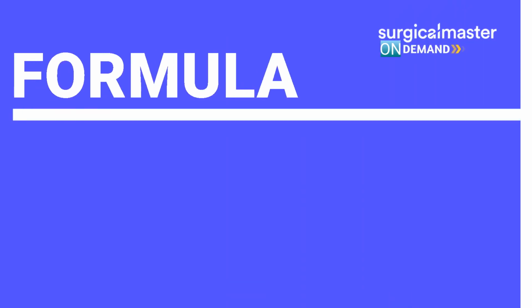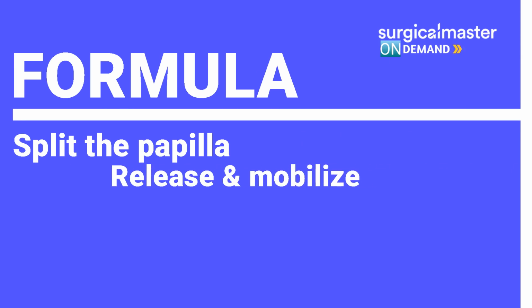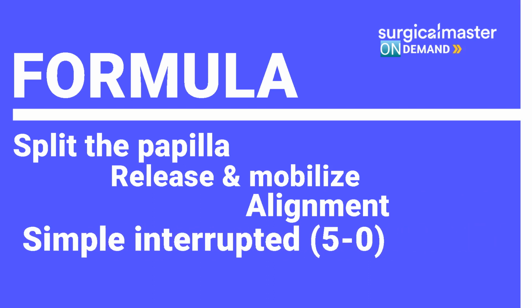So what's the formula here? The key is to split the papilla and release and mobilize the tissue. Align it so it fits like a prayer gesture. Simple interrupted with gut 5-0, and then you pray.